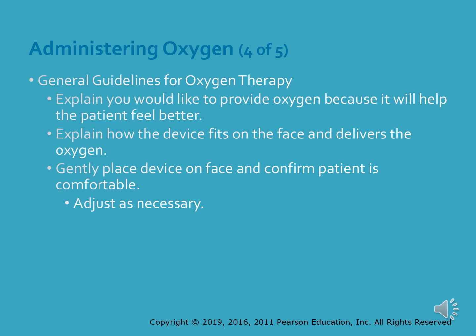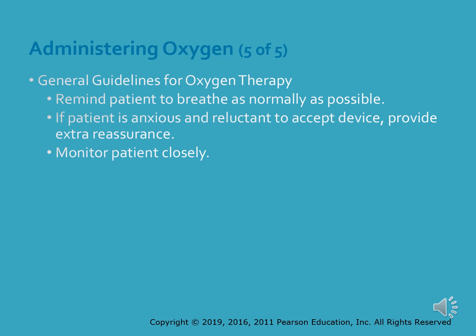Show the patient the device and explain how it will work and how it will fit on his or her face. At that time, gently place the device on the patient's face and confirm that he or she is comfortable with it, and adjust as necessary to make it comfortable. You then want to remind that patient to breathe as normally as possible. If your patient is anxious and seems reluctant to accept the device, provide extra reassurance.